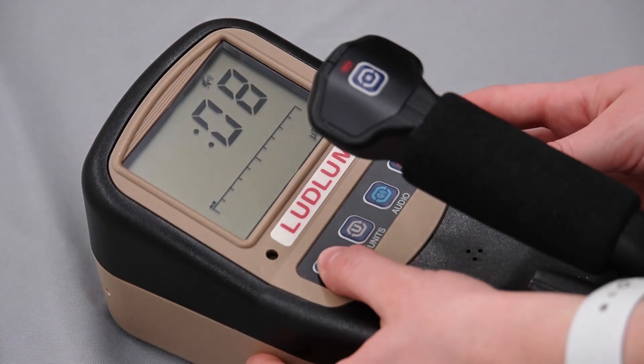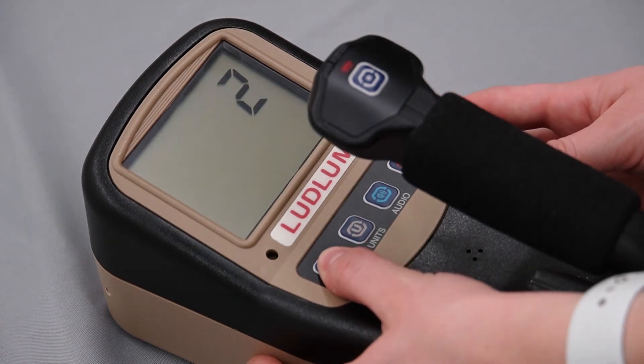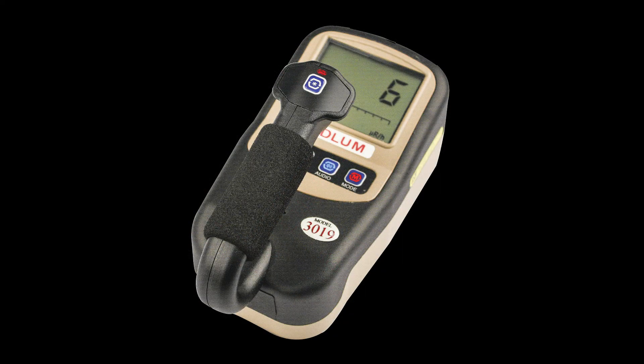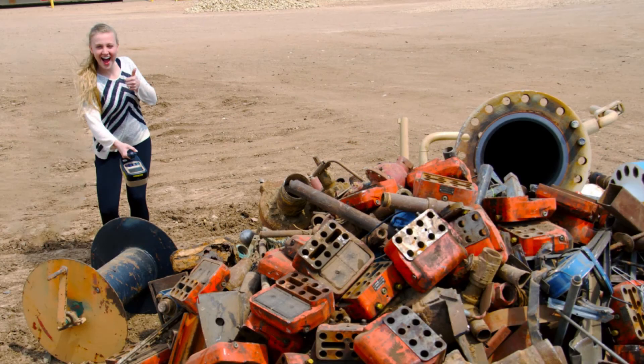A long press will commence the power down function of the meter. Here is a brief demonstration of the Model 3019 being used in a typical survey. This is only for demonstration purposes and is not meant to replace your local procedures.